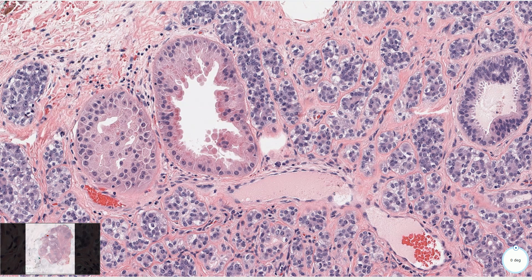Immunohistochemistry may be useful to visualize the myoepithelial component and also to make sure that the lesion is not invasive. All of these myoepithelial cells would be positive for myoepithelial markers like P63, S100, SMA, or cytokeratin 5. The epithelial component is positive for cytokeratin 7 and may express estrogen receptors.